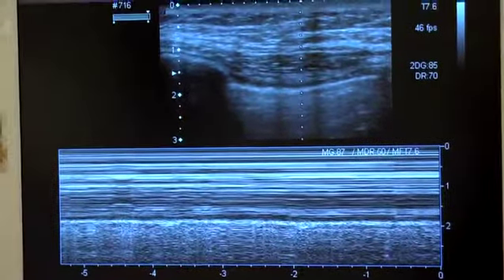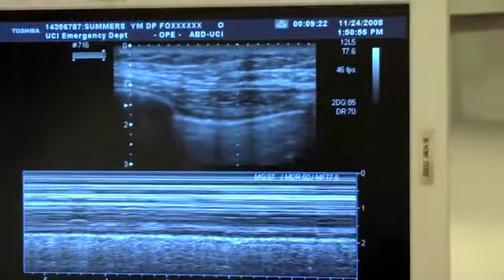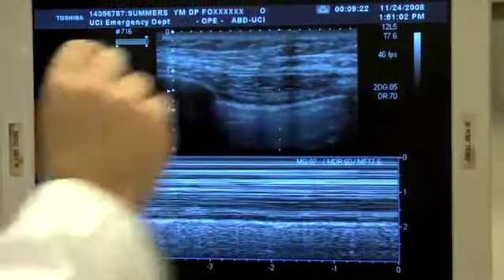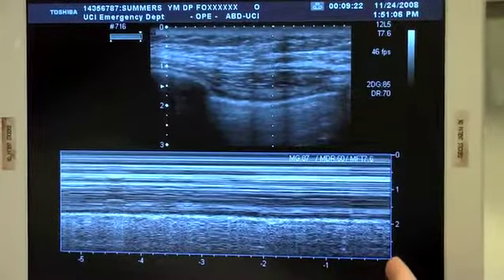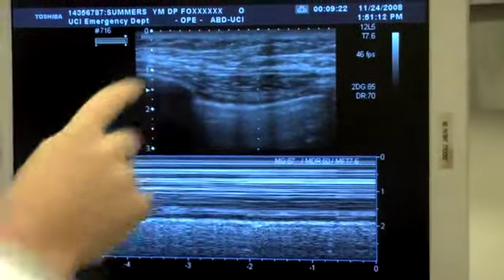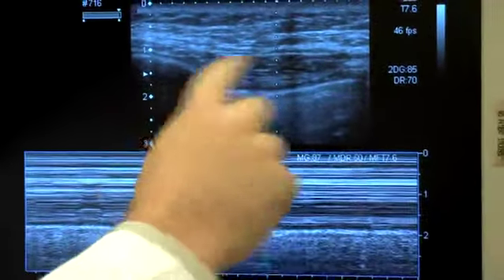Okay, so just to review, this is the screen you're looking for. This is the M mode, this is the B mode, and they're superposed on each other. That's called duplex imaging. This depth of 3 centimeters corresponds to this depth of 3 centimeters on the M mode image. This little section of tissue 1 centimeter down corresponds to the chest wall. This little section corresponds to the intercostal muscle between the two ribs. And this, at a depth of 2 centimeters, is the pleural line.